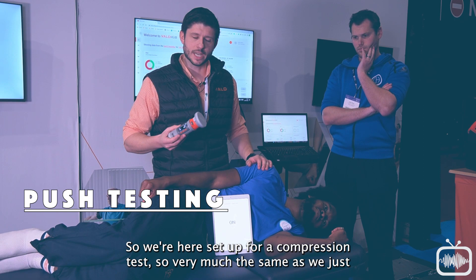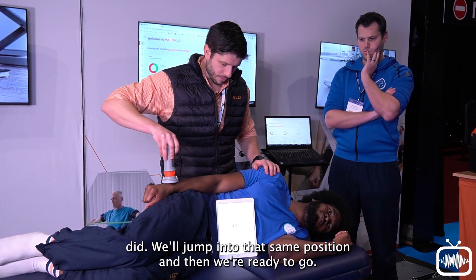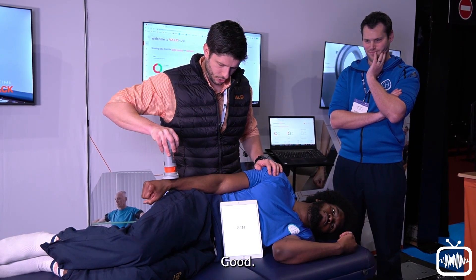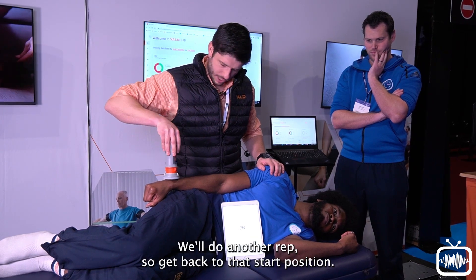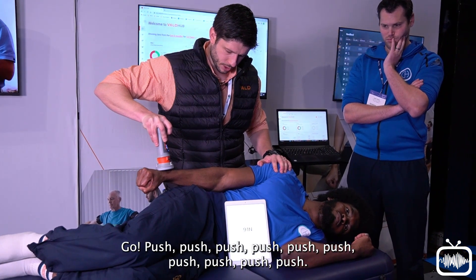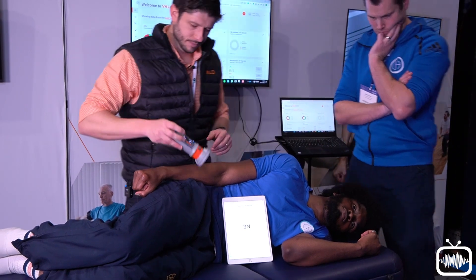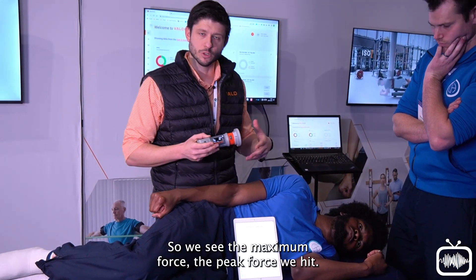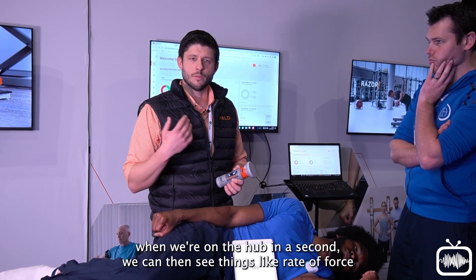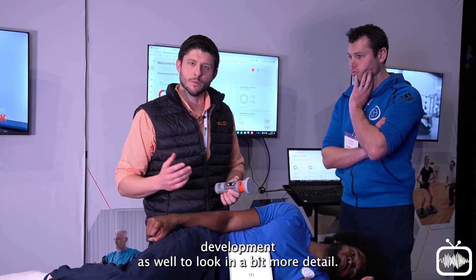We're set up here for a compression test — very much the same position as just done. Three, two, one — push — and relax. We'll do another rep — three, two, one — push — and relax. When we upload that data, we see the maximum peak force we hit, as well as the average of those reps completed. When we're on the hub, we can then also see things like rate of force development in more detail.